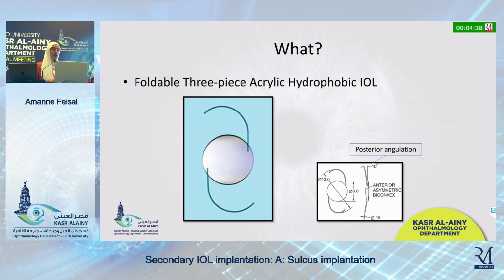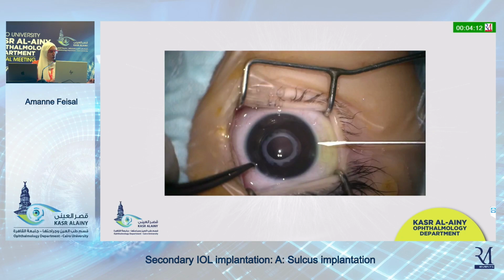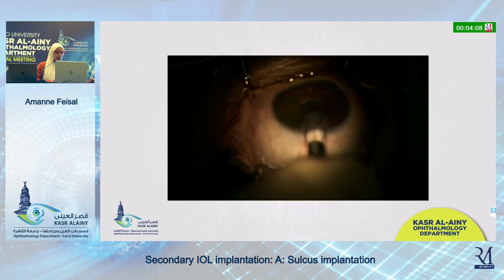And what are we going to implant? We're going to implant a foldable, 3-piece, acrylic, hydrophobic IOL. Whichever the brand is, we need an IOL that has a large overall diameter, 13 millimeters, and an optic that is big, 6 millimeters, and a posterior angulation to keep the optic away from the iris so it wouldn't be rubbing against it. The technique here is shown in detail, and the case is a resident case.